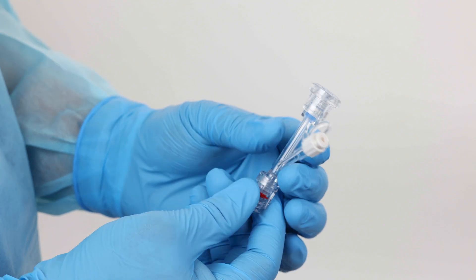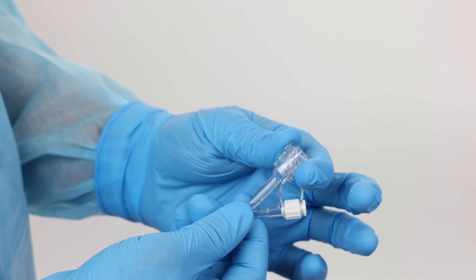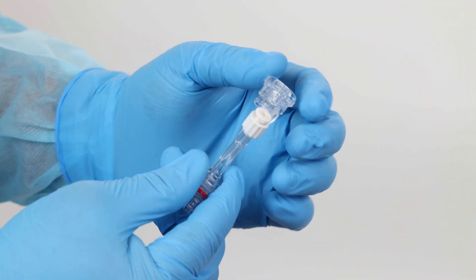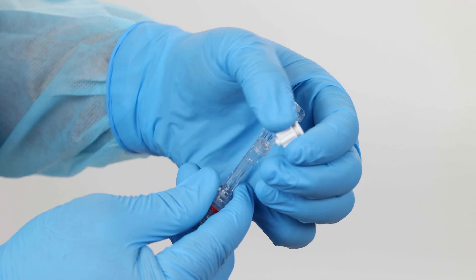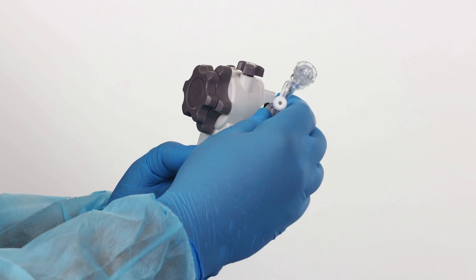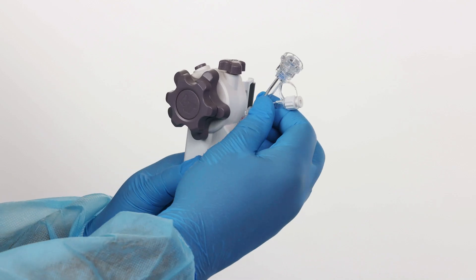Prior to using the Y port adapter, visually inspect the adapter and ensure the working channel port is open. To use the injection aspiration port of the Y port adapter, remove the Luer lock cap. Use the Luer connector to connect the desired injection or aspiration source. If desired, connect the Y port adapter to the working channel port on the IMAX scope handle.